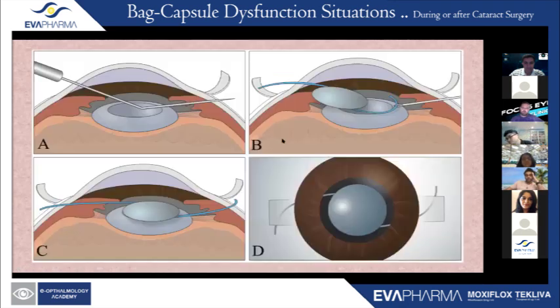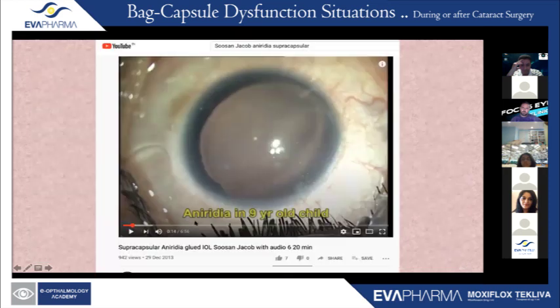And this is basically an illustration from that book, which shows the mechanism. You've done a phacoemulsification. You've got the empty bag here. So you're not putting the intraocular lens into the bag. Rather, you've made the sclerotomies and scleral flaps, and you've externalized the haptics one after the other through the sclerotomies. And you've got the IOL now stable over an intact bag.